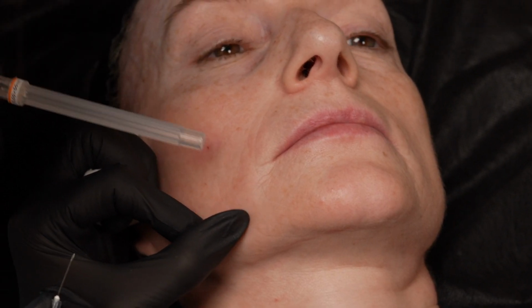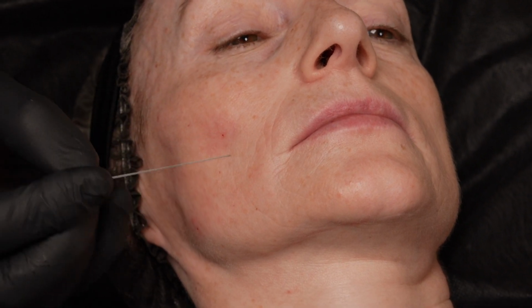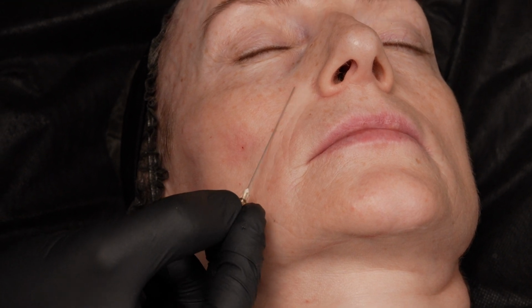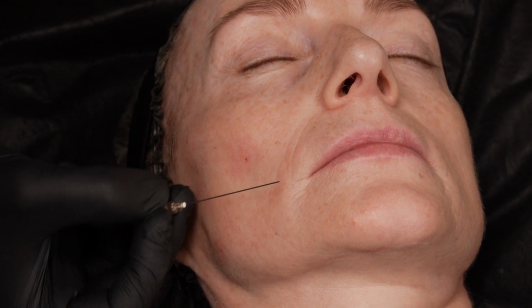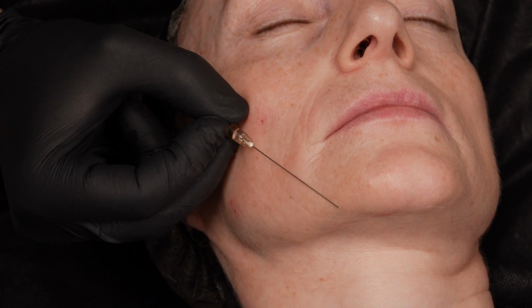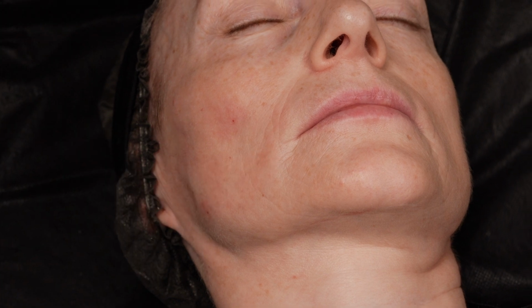The important entry points. You check your cannula. For example, this is dirty. I can show it. When you enter from here, check. Okay, I can reach here. I can reach here. I can also reach here. It's good. You can open around here.